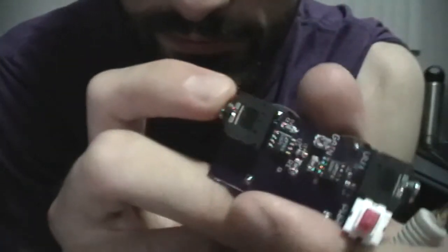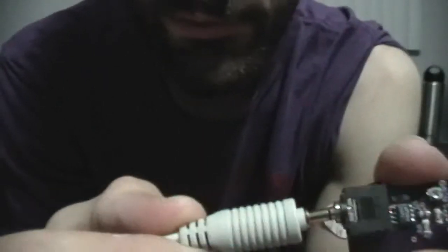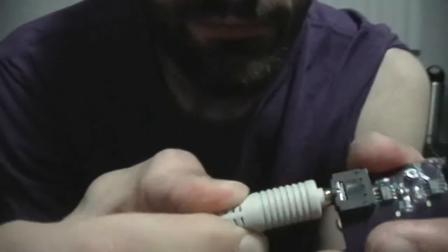I guess it could be considered a general purpose amplifier. You have two stereo jacks on each side, one for input, which takes electrode connectors, and they snap onto electrodes like this.